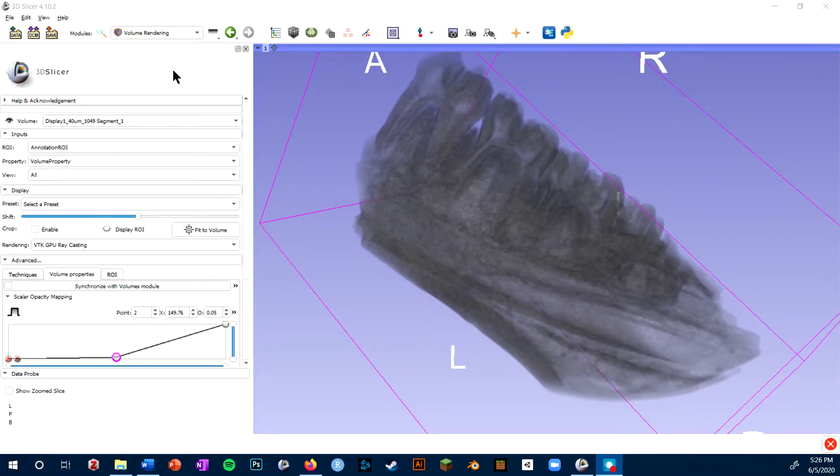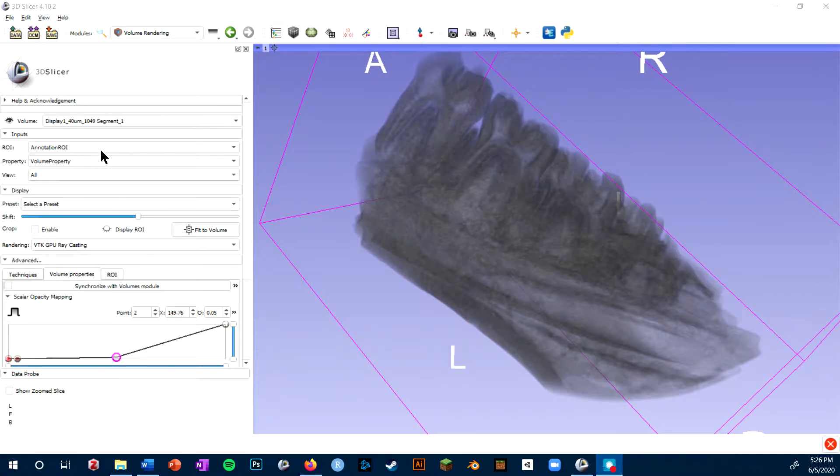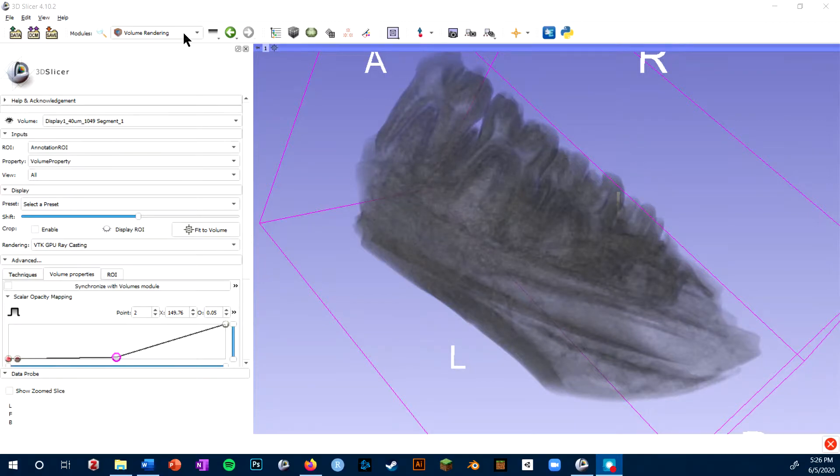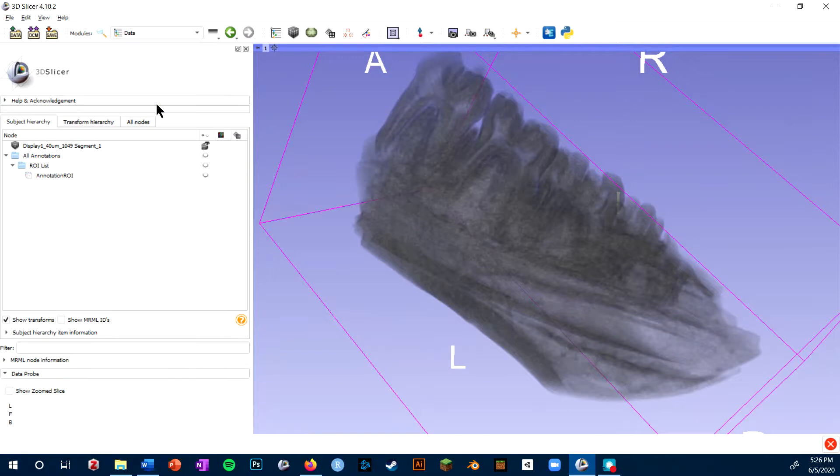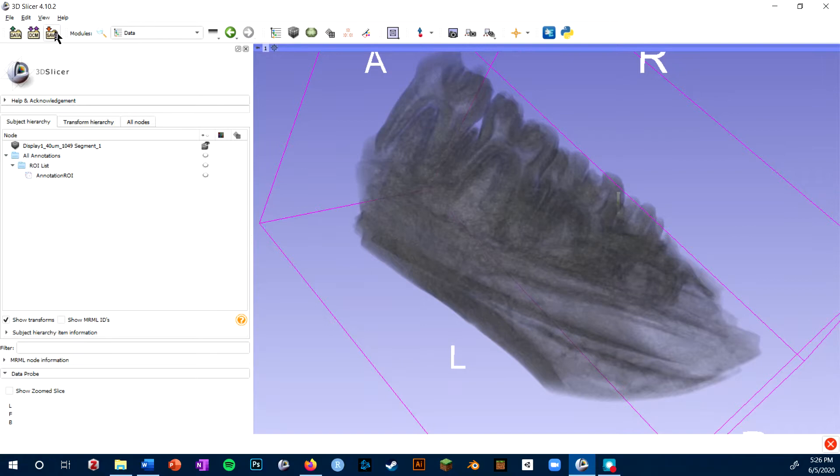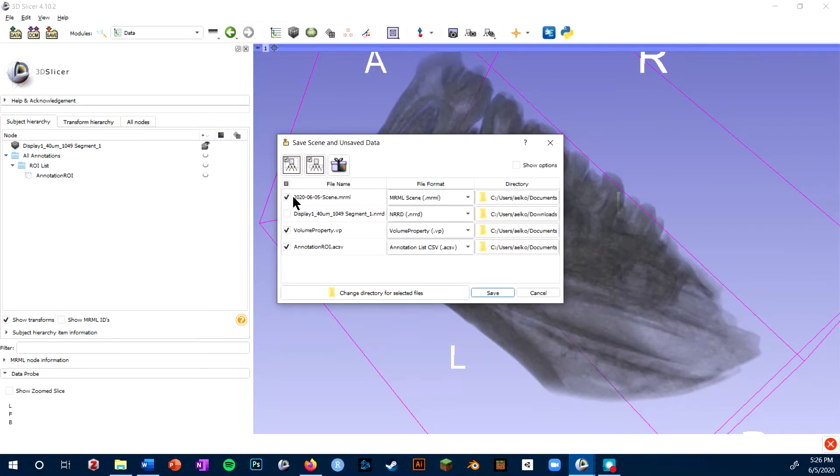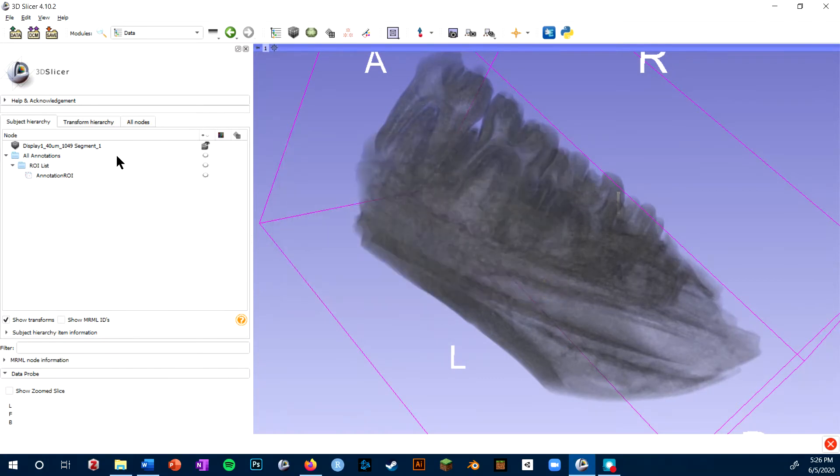One final thing to note is that both this volume properties that you create and the annotation ROI will be separate objects in your Slicer scene. So if I hop back to this data tab we've looked at before, you'll see I have this annotations list. And then if I click save, you'll see I have an option to save the volume property. So it's useful to remember that those are separate objects.